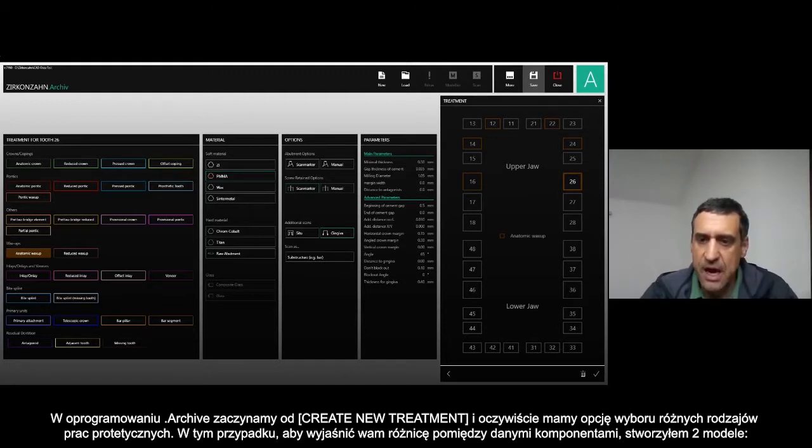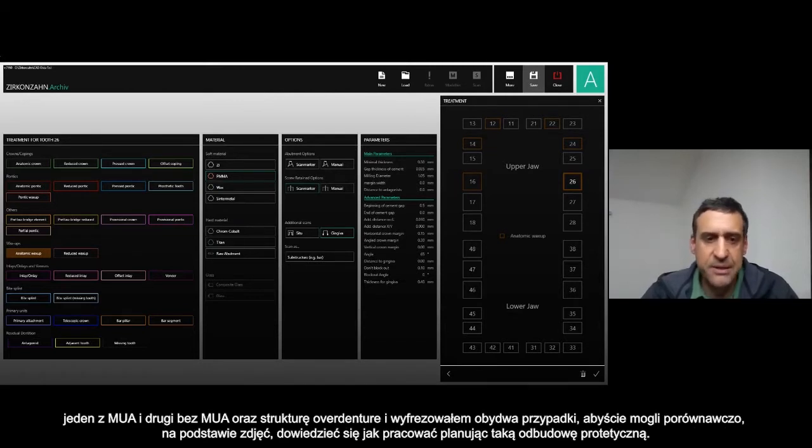I prepared two different models: one with the multi-unit abutment and one without any multi-unit abutment, with the over-structure.